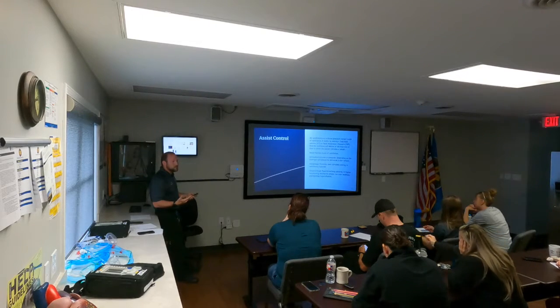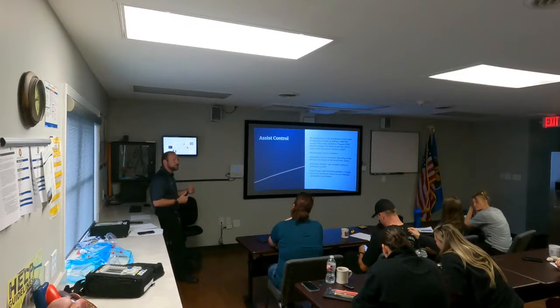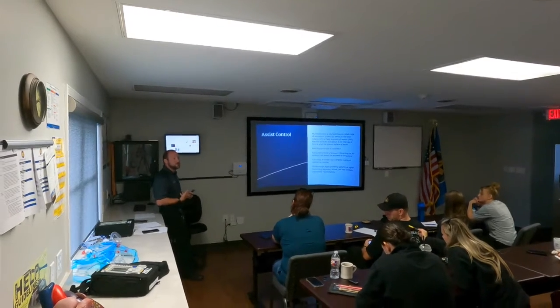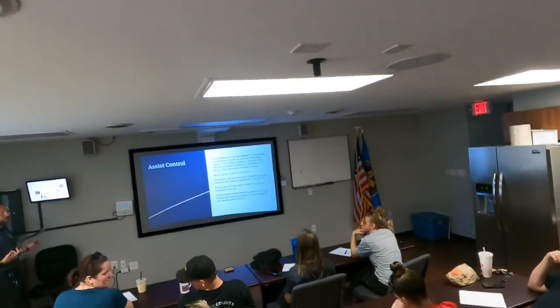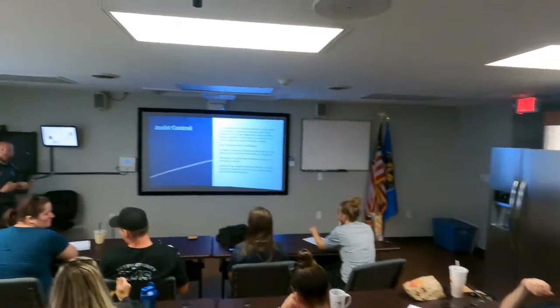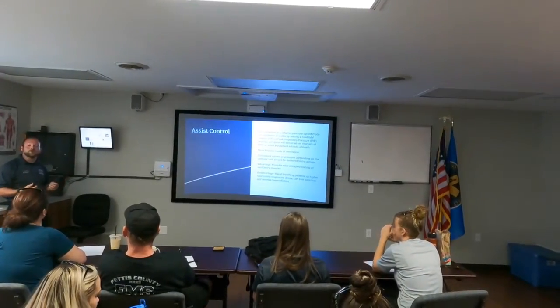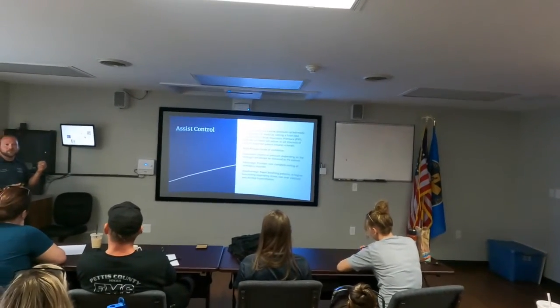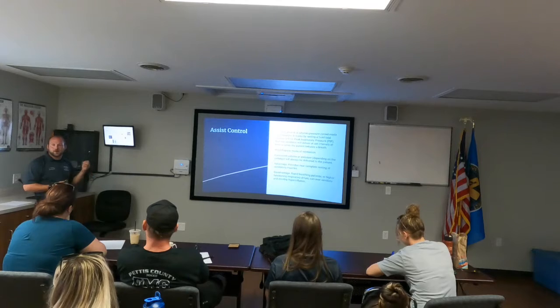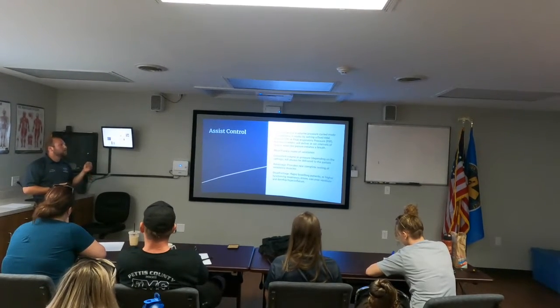It's kind of nice in the aspect that if someone is in respiratory failure or has completely lost respiratory drive, you're going to be able to give the diaphragm a chance to rest while the ventilator breathes for the patient. That's pretty nice when we use paralytics, especially if we initiate our intubation with a long-term paralytic. AC mode is going to give them that constant pressure, that constant volume, regardless of what's going on with them.